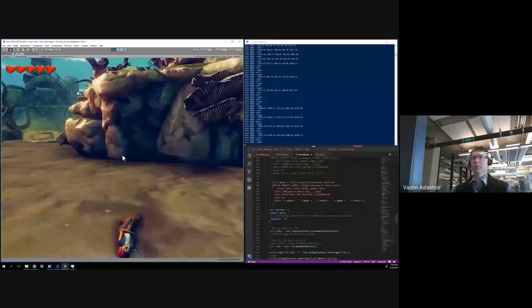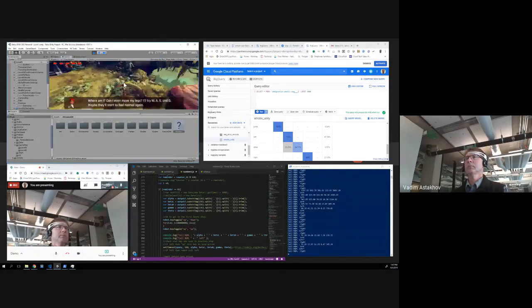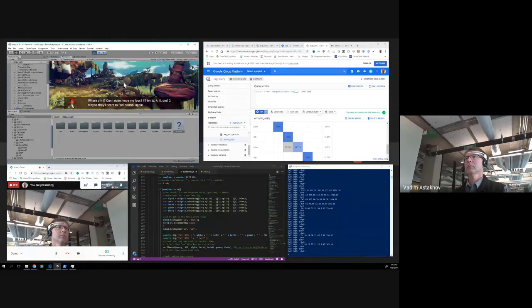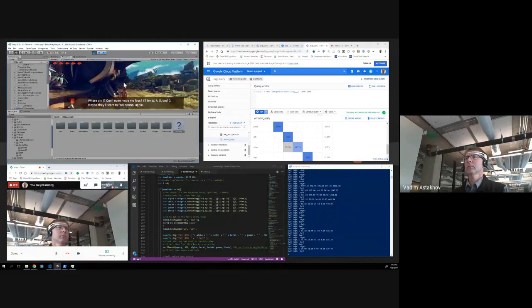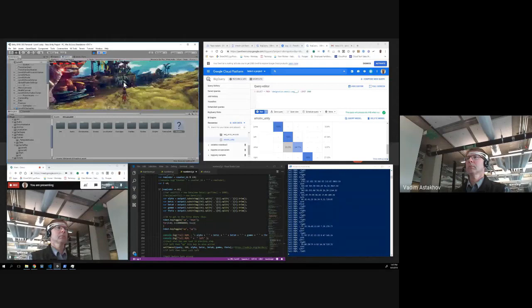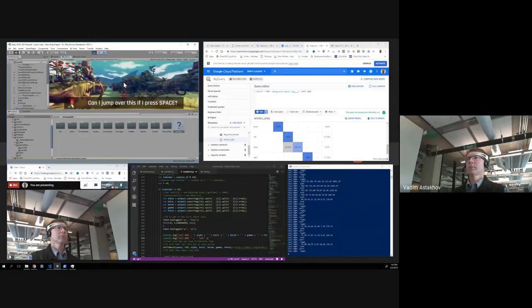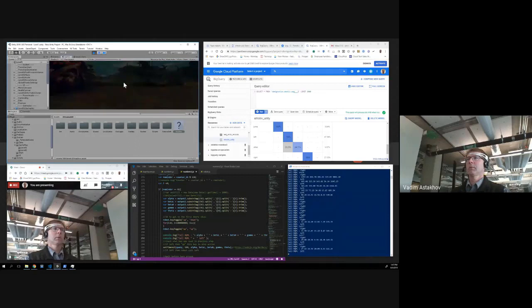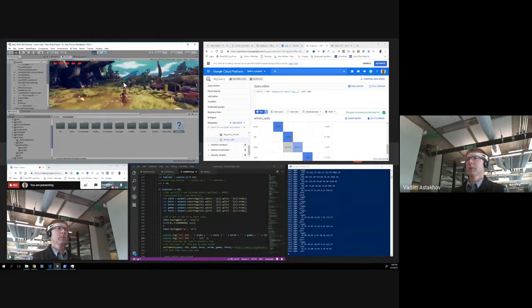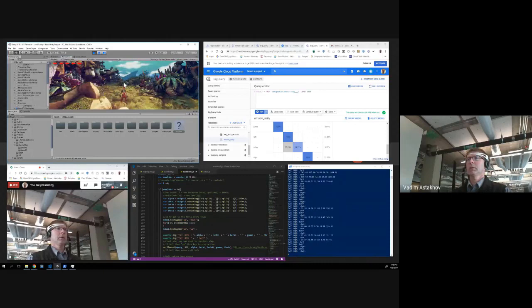Obviously, you need certain discipline to clearly think about the commands and actions. Well, and obviously I'm lost. So now, as you can see, the environment starts operating automatically, but because I'm speaking, the type of command is probably not relevant. But essentially, it lets me control the game.